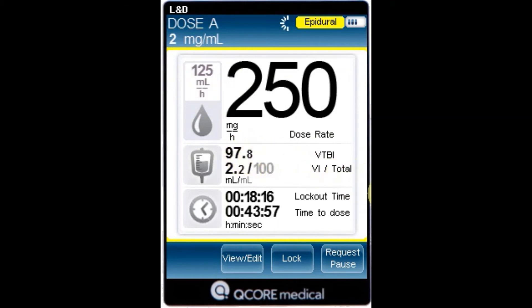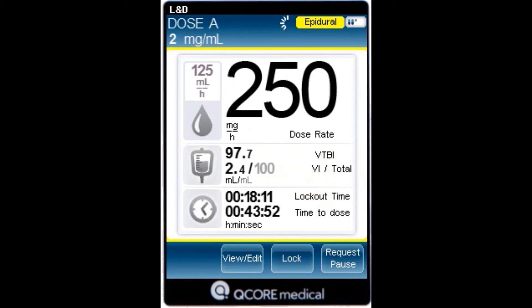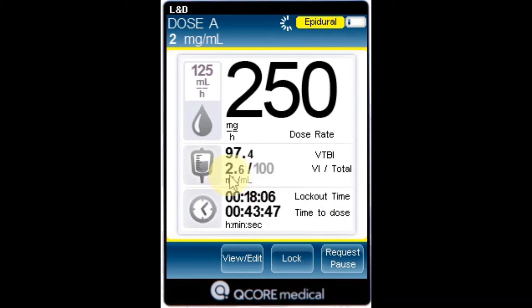VI over total — the total volume delivered in the current infusion, including KVO if applied during a delayed start period, over the total VTBI value programmed. As the infusion progresses, the VI increases and the total remains constant.